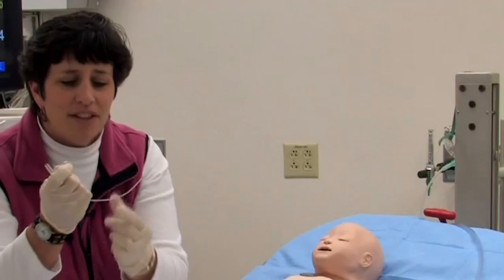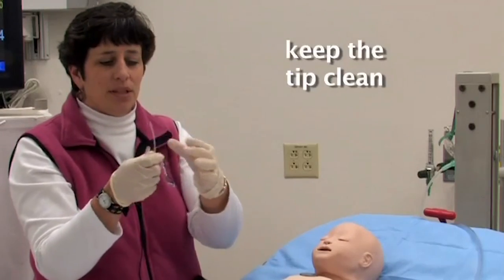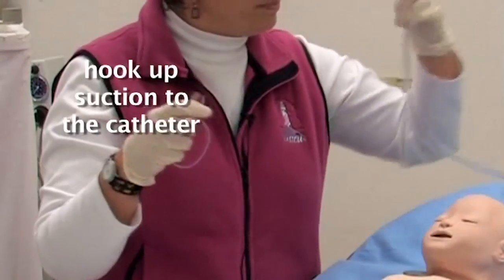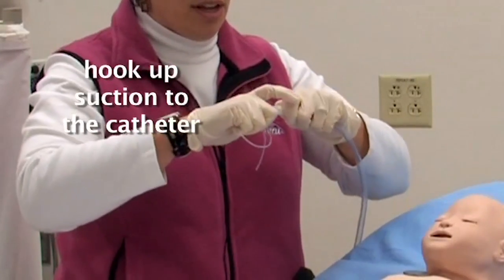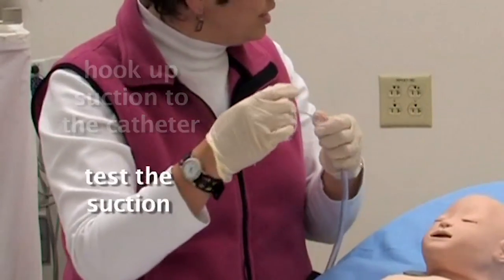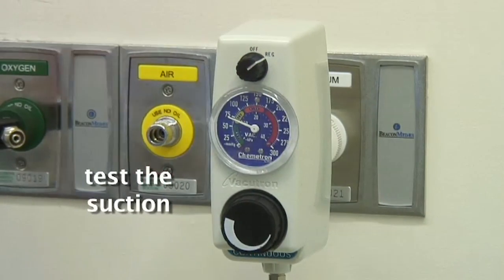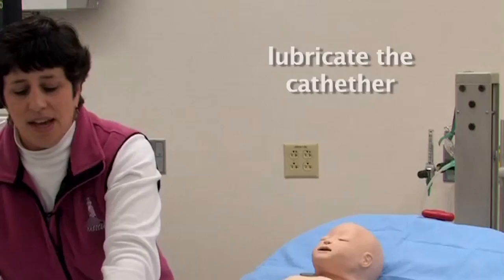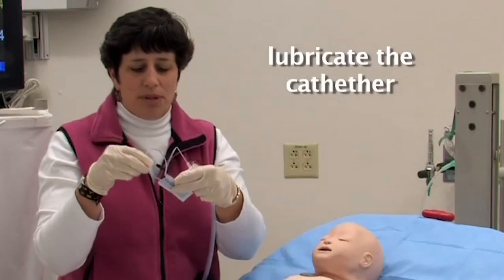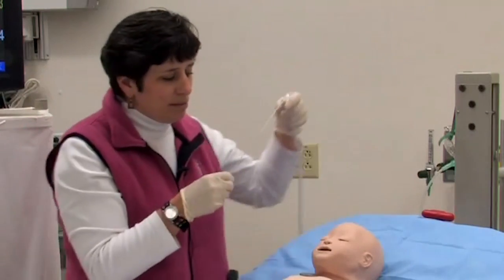I am going to remove my catheter and keep the tip clean until I put it into the patient's nose. I am going to hook up the suction to the catheter and test the suction to make sure it is not too high. I am also going to lubricate the catheter to make sure I do not cause any undue trauma to the patient's nose.